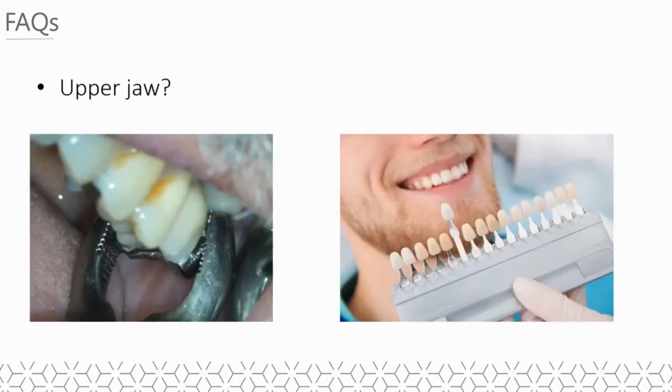Why would you use intraosseous anesthesia in the upper jaw? First, for the efficiency. Infiltrations do indeed generally work very well in the upper jaw, but sometimes for long canines or upper molars, the palatal root will sometimes not be perfectly anesthetized. With intraosseous anesthesia, it will always be effective, even in these specific cases.